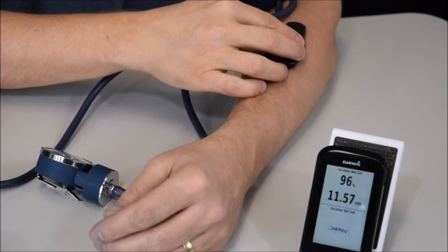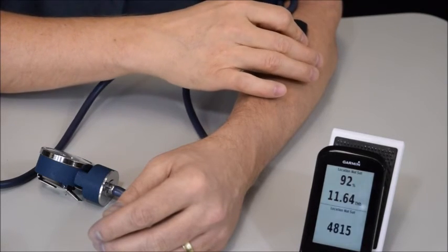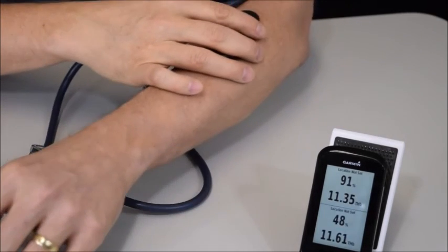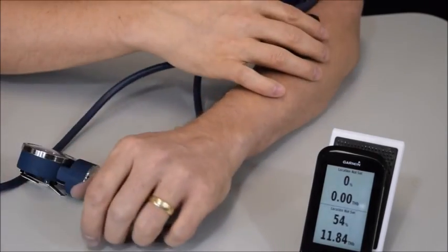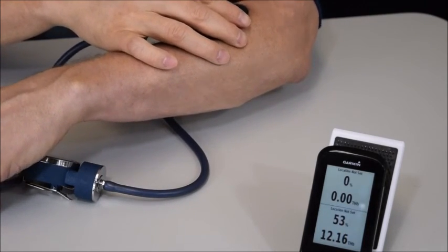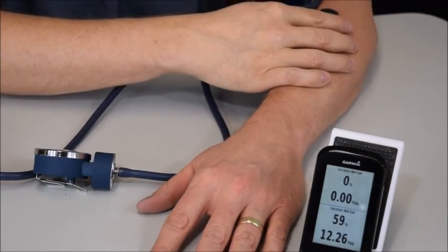Okay, take a reading. Come on. Give it just a few more seconds to take a reading. Okay, there we go. So then I'm going to go ahead and release this cuff. And you can see the color hopefully returns back to my hand. Oh, it's nice and pink again. That's what we want to see.